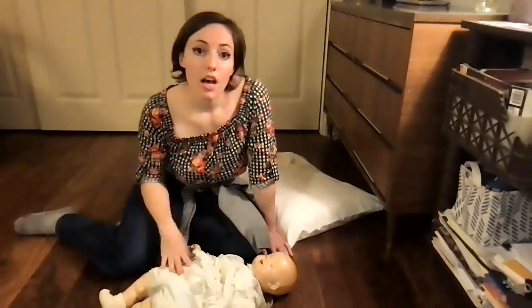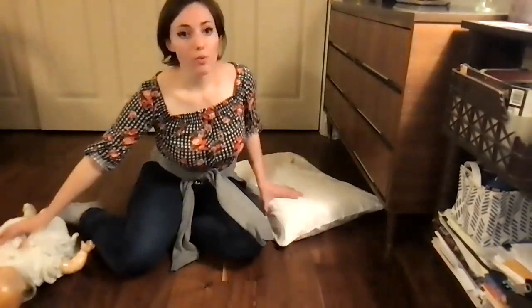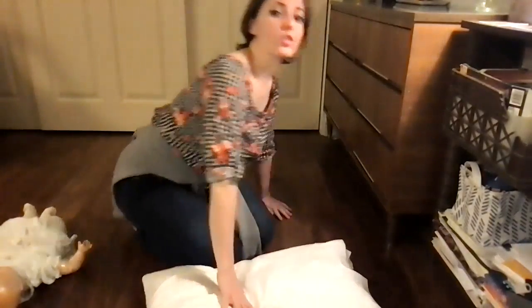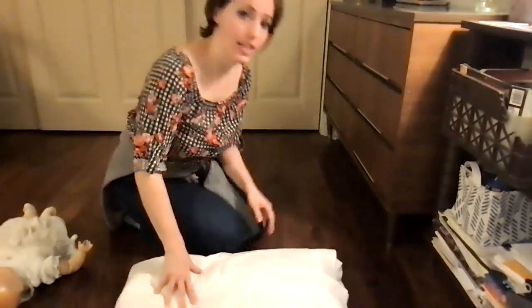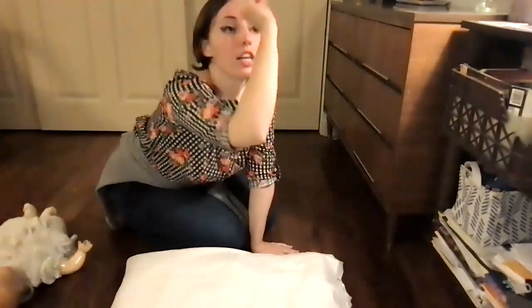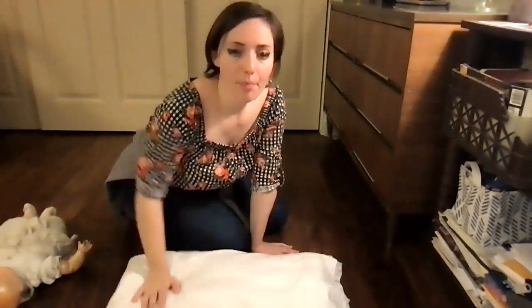All right, so that's the skill. We'll just run through it one more time really fast. So you come on scene, somebody's on the ground, you're gonna tap them. Hey sir, are you okay? Are you awake? They're not. You're gonna point to somebody and say, you call 911, tell them there's a person unconscious, get back to me. Then you're gonna point to the other person, get me an AED and get back here ASAP.